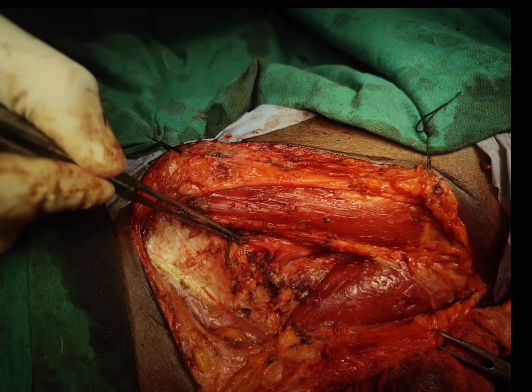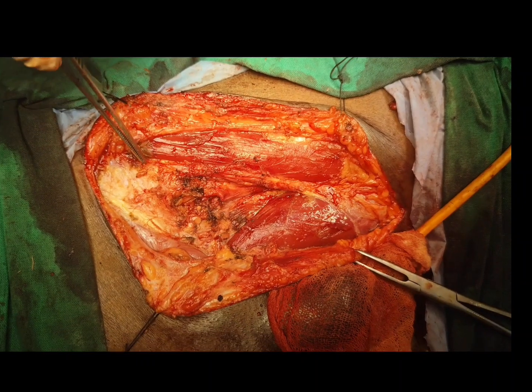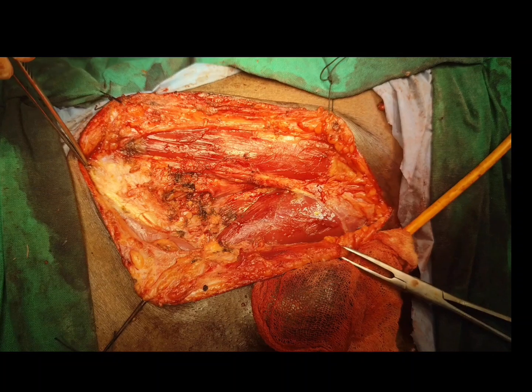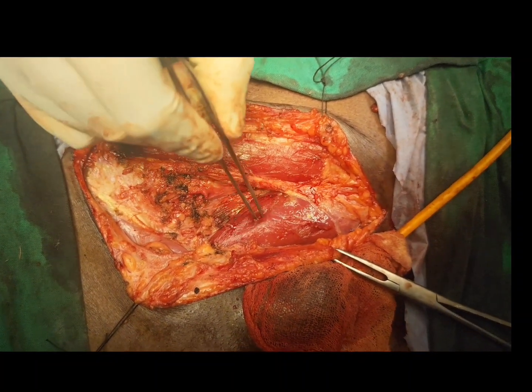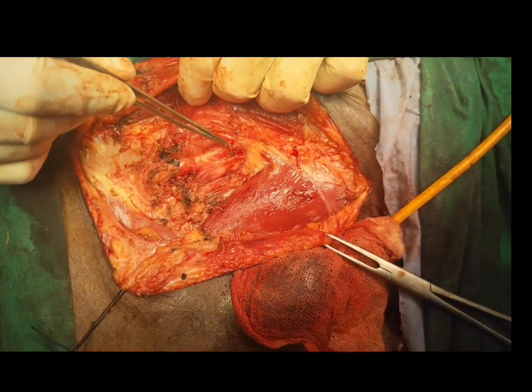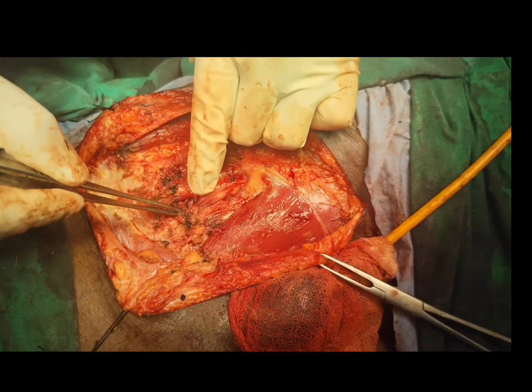Here we can see the picture of inguinal lymph node dissection with the superior part on your left side of the screen. Here we can see the psoas major, the inguinal ligament, the adductor brevis, this is the adductor longus, and this is the sartorius forming the lateral boundary. Here we can see the femoral artery, the pulsations can be seen clearly.